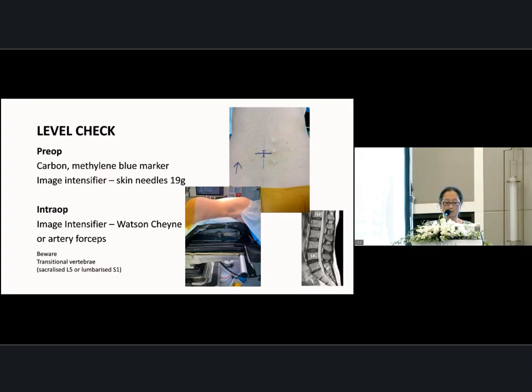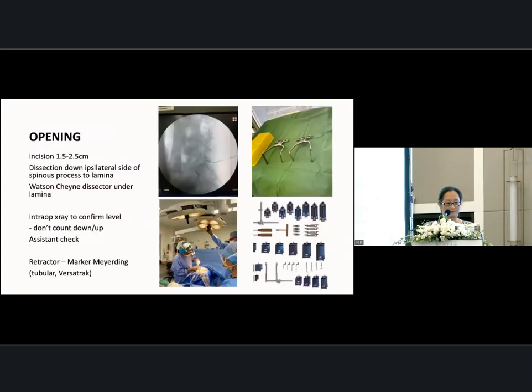It can sometimes be very difficult to see if you've got the right level, particularly if the II shot's not that great, the patient's very fat, you've got someone who's having trouble, or you've got a junior II person. It's always good to have a good second pair of eyes, so have an experienced assistant with you.